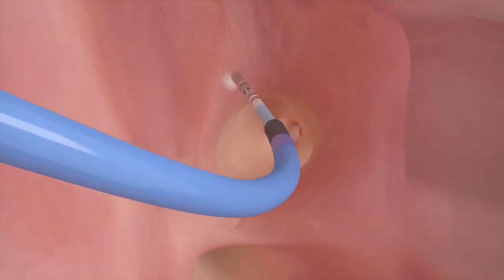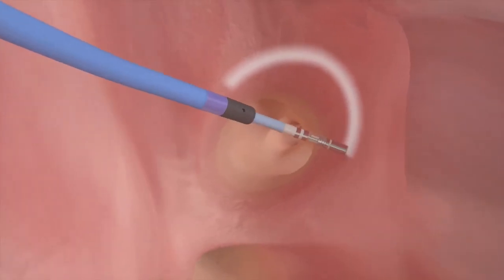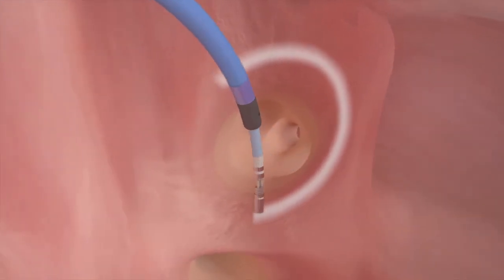This advanced technology enables doctors, for the first time, to precisely and accurately control how much pressure they're applying against the heart wall to ensure optimal outcomes.